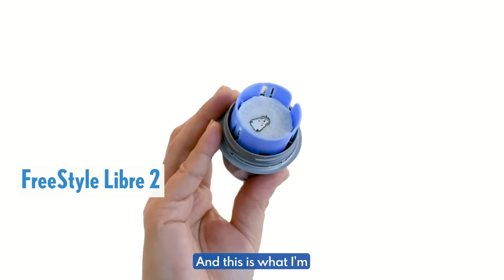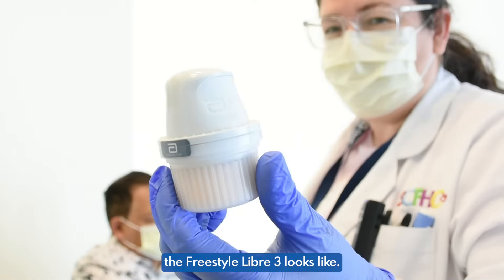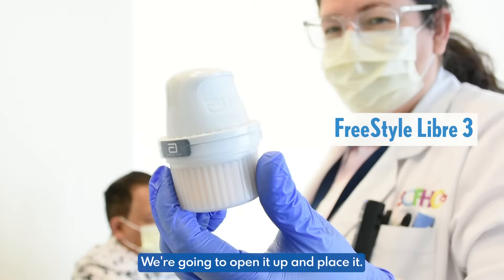This is what I'm going to place in my arm. And this is what the Freestyle Libre 3 looks like — we're going to open it up and place it.